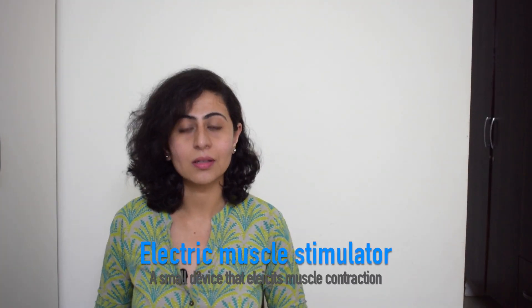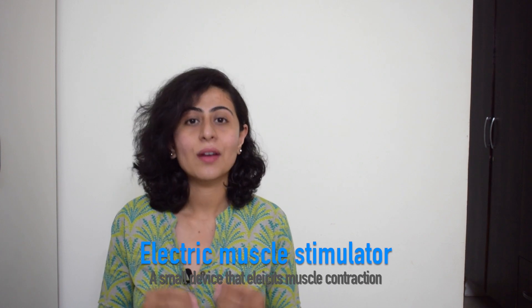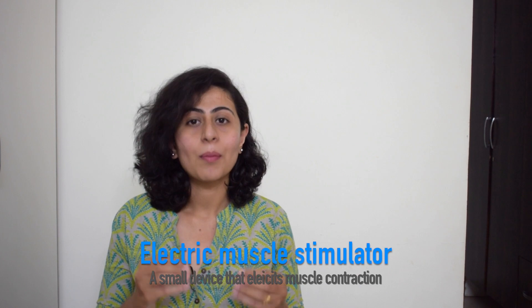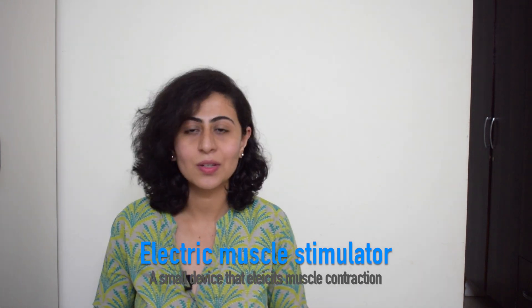There are a lot of therapeutic effects that you can achieve with the help of EMS. But beforehand, let me show you what exactly EMS does. An electrical muscle stimulator is basically a small device which elicits tiny current impulses which help in eliciting contraction among the muscles that are denervated or injured because of facial paralysis.